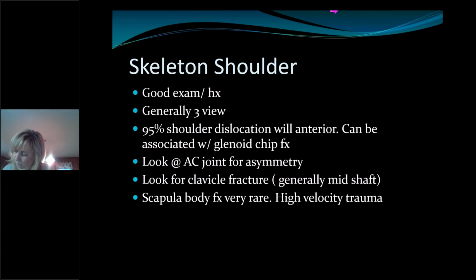So let's move on. Skeletal shoulder. Again, with shoulder, a lot of this is, how much, where do they hurt? Is it anterior? Is it posterior? Is it lateral? Not everything's the rotator cuff, as a lot of patients like to call it. There's a lot of different pathology that affects the shoulder. From a bony perspective, obviously, you can have trauma, certainly have chronic degenerative changes.